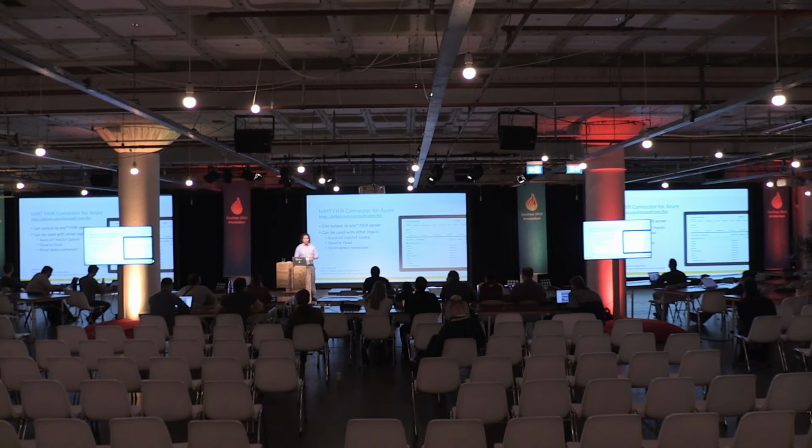So there are a couple things that I want to point out. Number one, the IoMT FHIR connector can point to any FHIR server, so you don't have to use the Microsoft offering. You could use another one. We recommend using the Microsoft offering, though. There's a minimum set of requirements. It has to be R4. It has to have CRUD for patient, device and observation. And you have to have an OAuth 2 identity provider set up. And those are the only requirements.